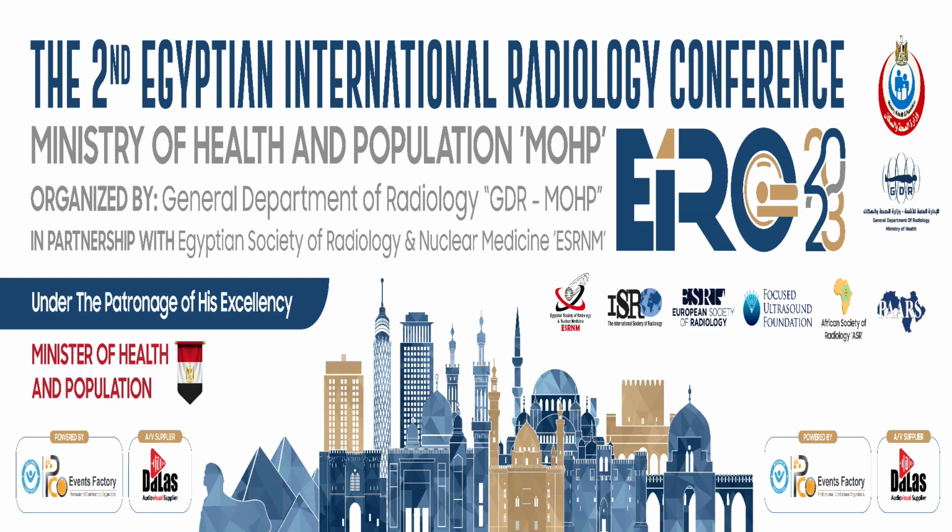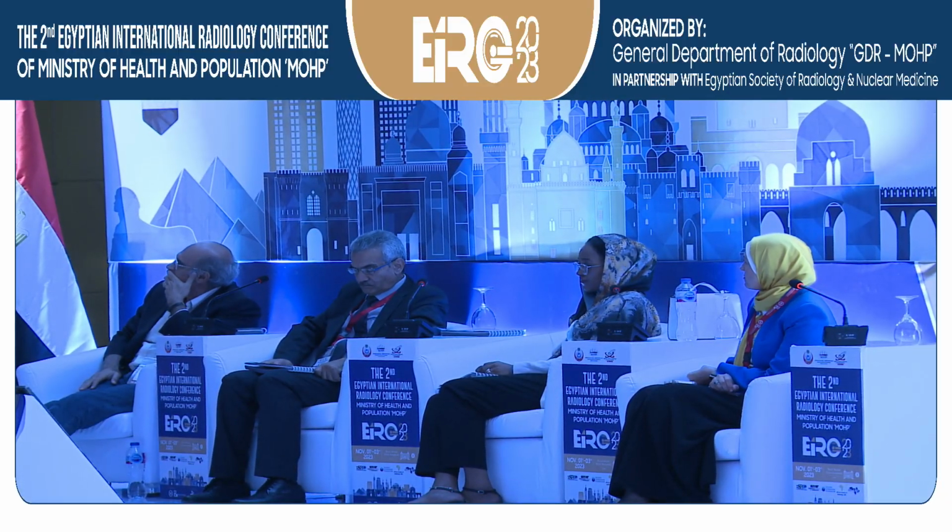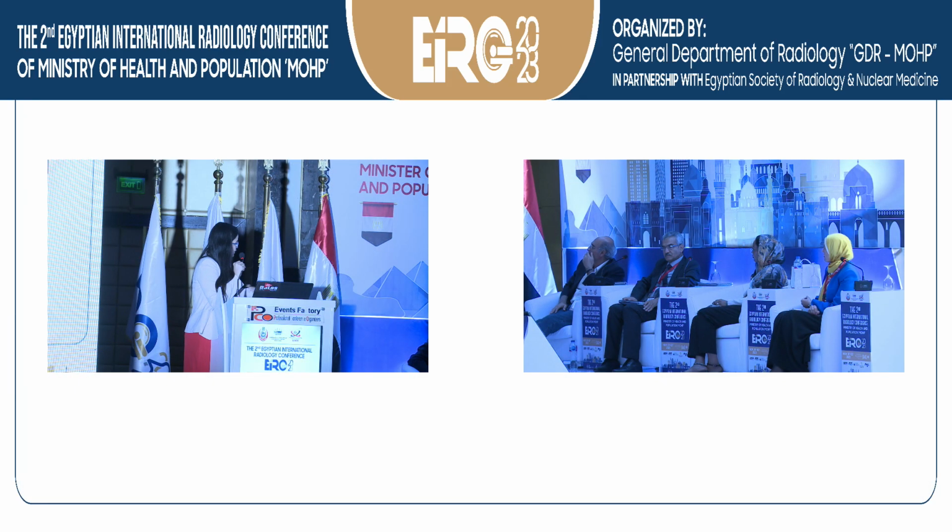Any question? Yes, I have a question, please. Regarding the ultrasound for fat quantification, does the body mass index of the patient affect the outcome? Okay, doctor, this is a really nice question. We have been doing the studies. One of the studies has already been done, and no, it doesn't affect. Even high BMI patients we have done, because it is not taking the outside skin parameters. It goes inside the liver, and as soon as you have a nice liver image, you can have it. So it doesn't affect at all.